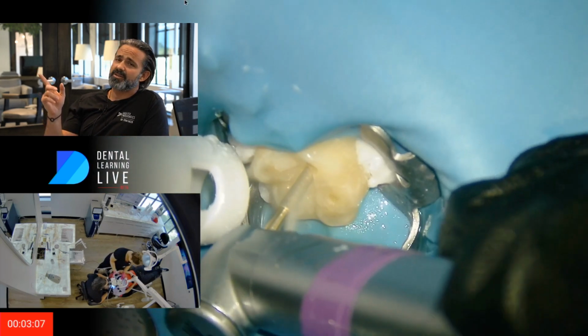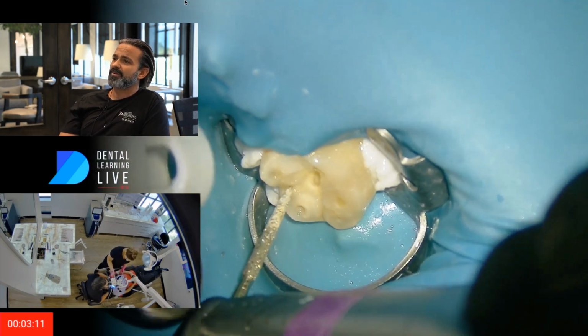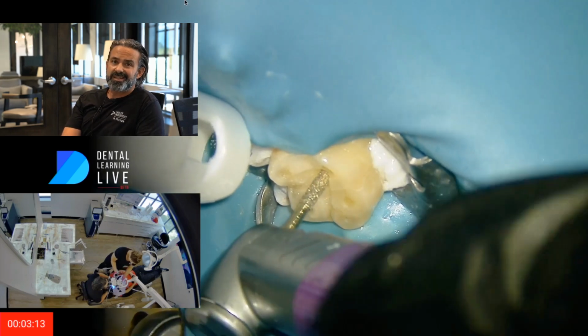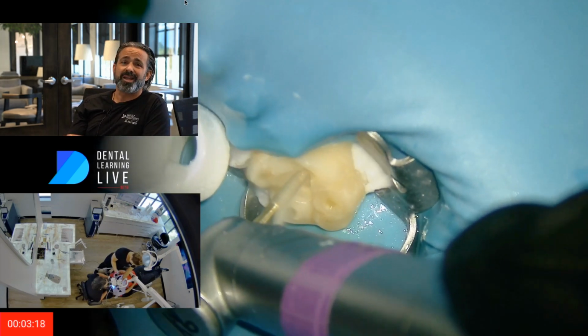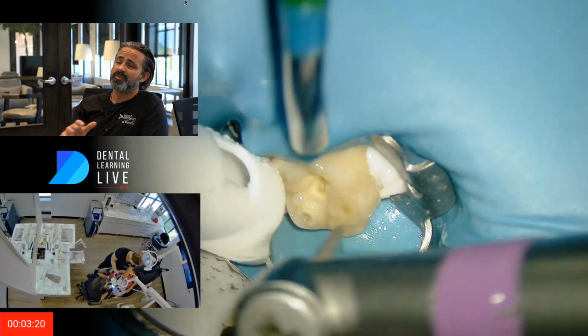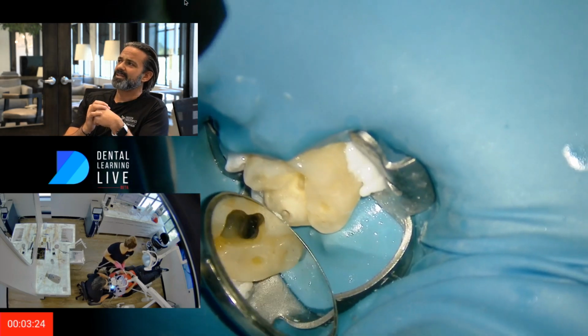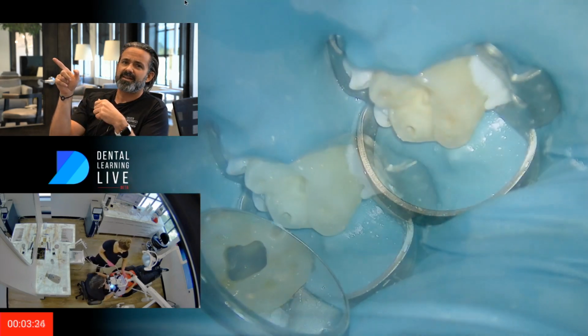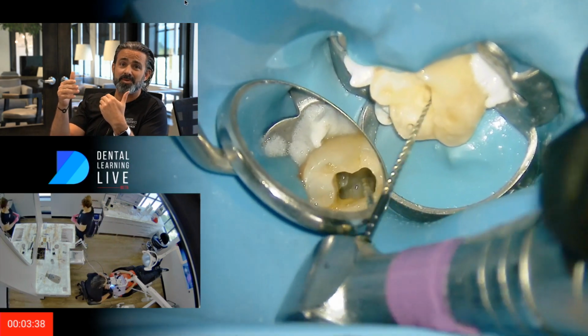And then this is an Endo Z burr, and I really like that. Part of the reason I'm using the Endo Z here is I'm not really that concerned, like I used to be in my career, about removing all pulp horns and all the pulpal roof. But I'm using it because as I'm into that, I'm noticing that feeling where I talked about maybe that was a pulp cap.